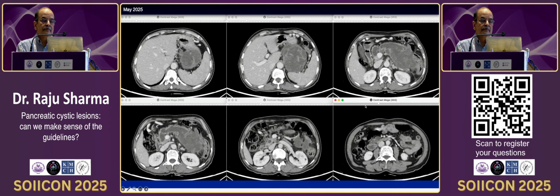It's difficult to evaluate smaller lesions because they do not show the typical features, but it's sometimes even more difficult to evaluate very large lesions because they lose some of the typical features that you have read in the textbook. This is perhaps the largest IPMN that I have seen in my practice. There is a large cystic lesion involving almost the entire pancreas, but notice it becomes easy to discern the ductal appearance of this. This is a tubular appearance. This is actually a grossly dilated main pancreatic duct with a large lesion involving the tail, which has solid areas.